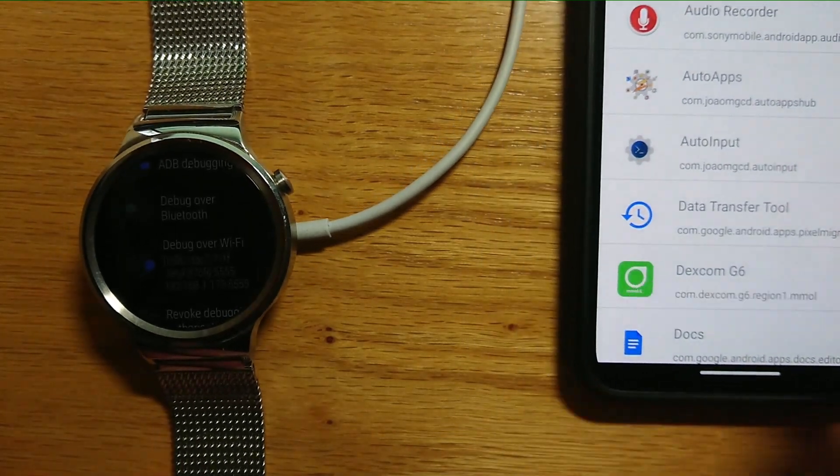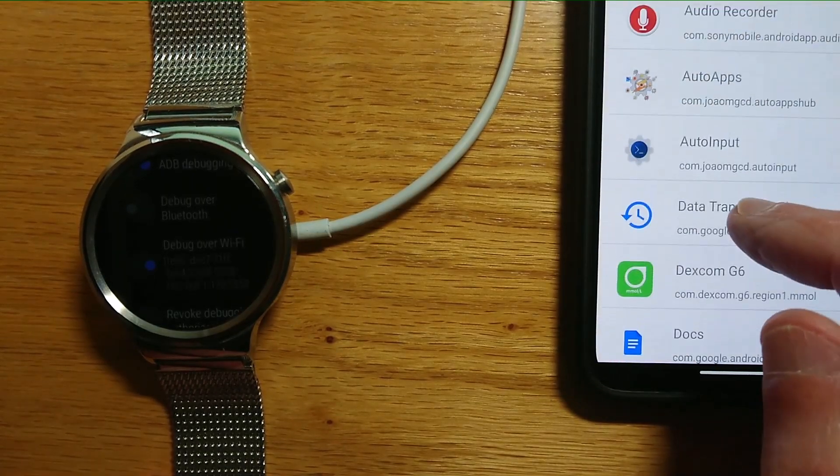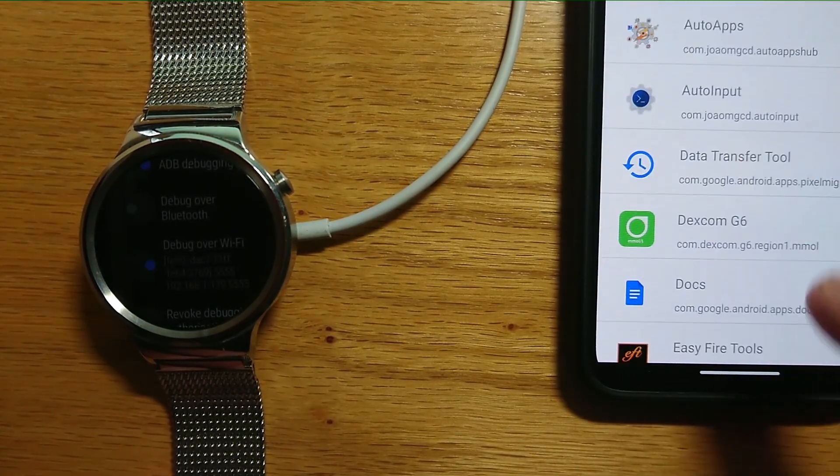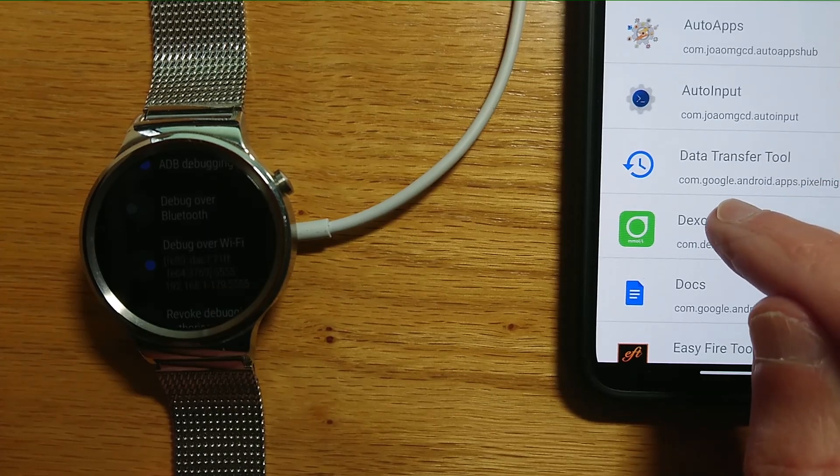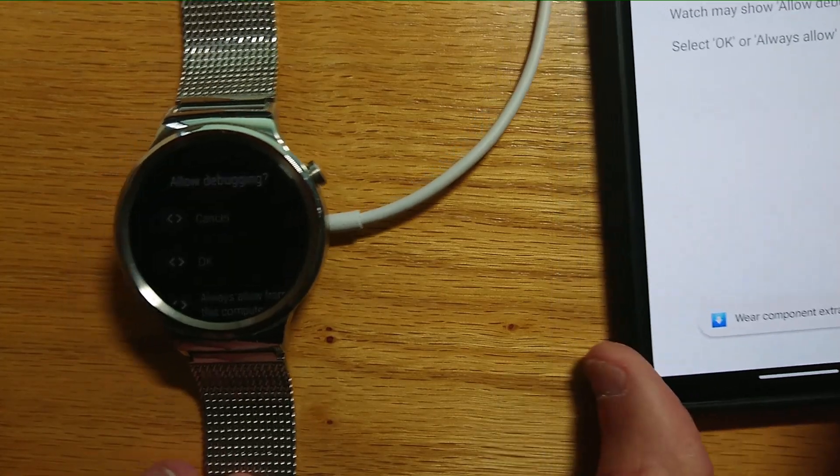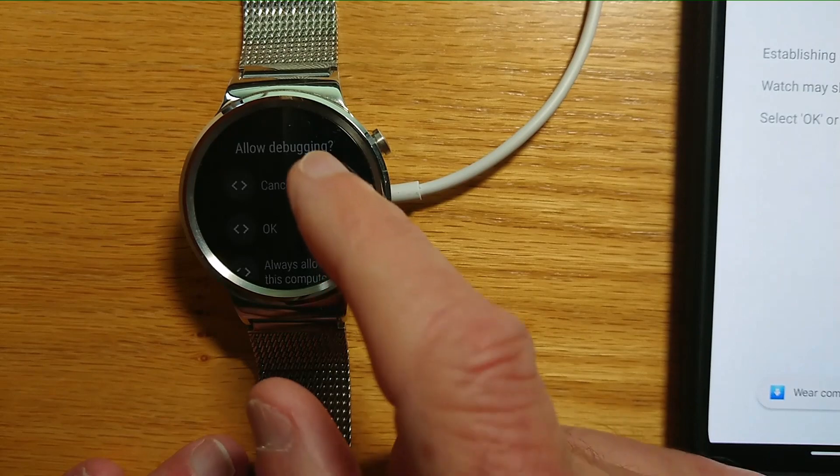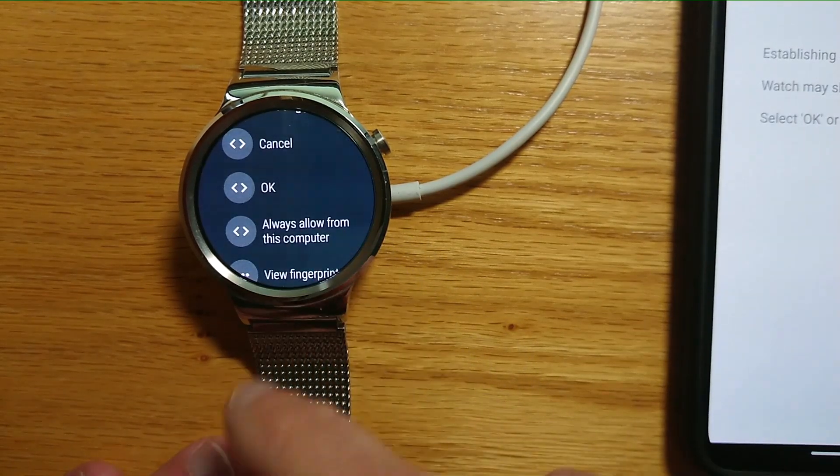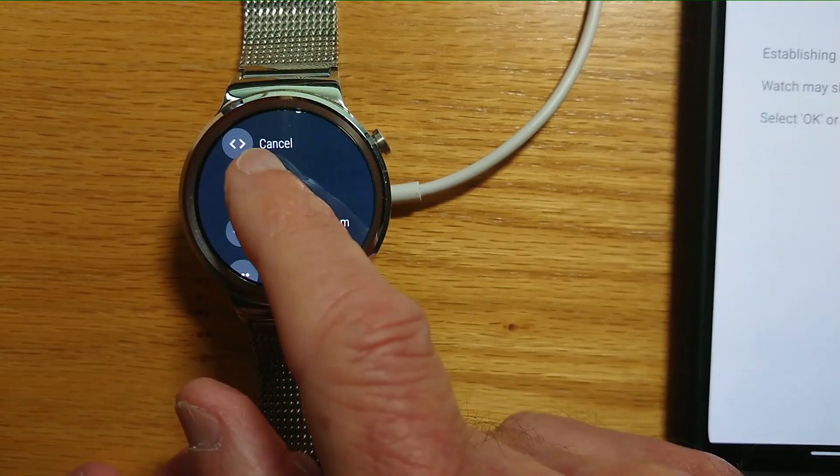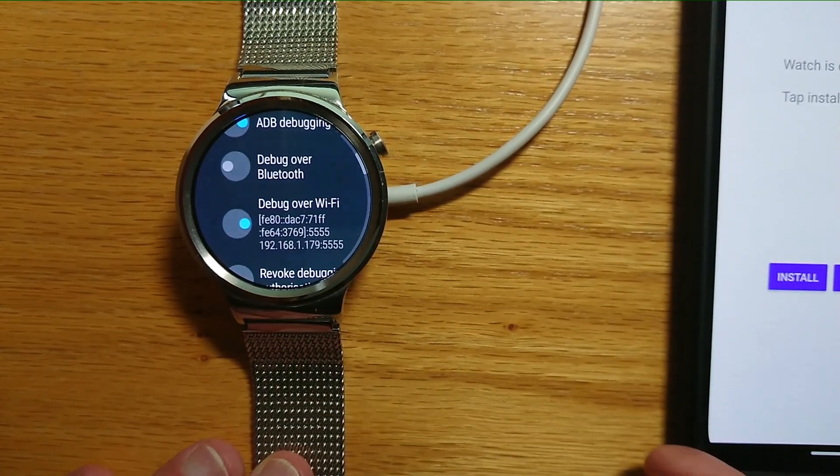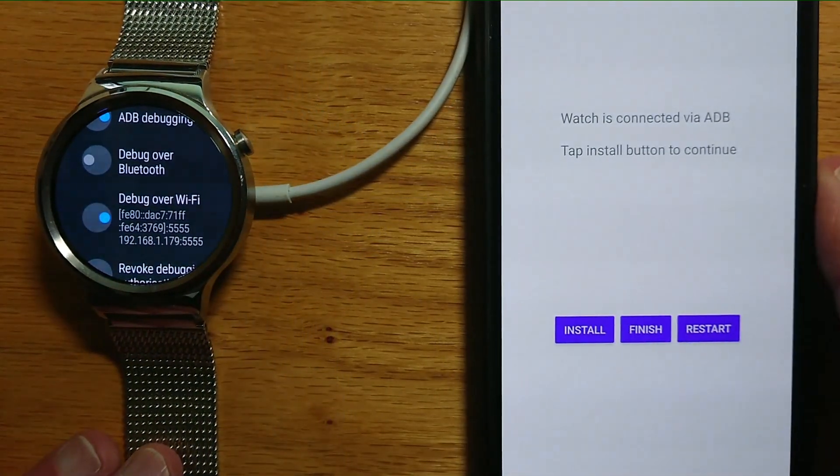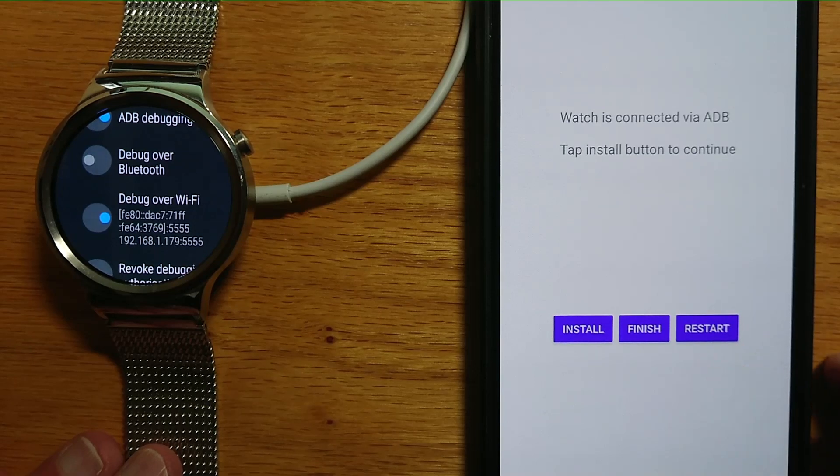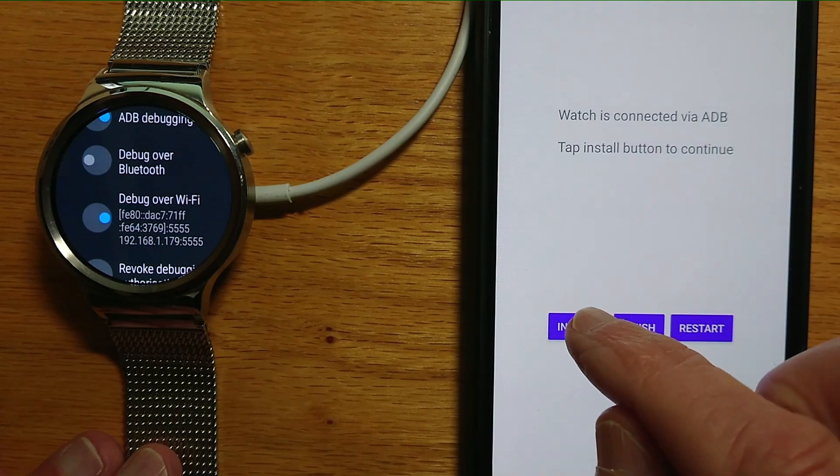Now you'll see a list of all the installed apps, and Dexcom G6 is there. Let's tap on it. The phone and watch are trying to make a connection over Wi-Fi. Let's allow that on the watch. Now let's select Install and see what happens.